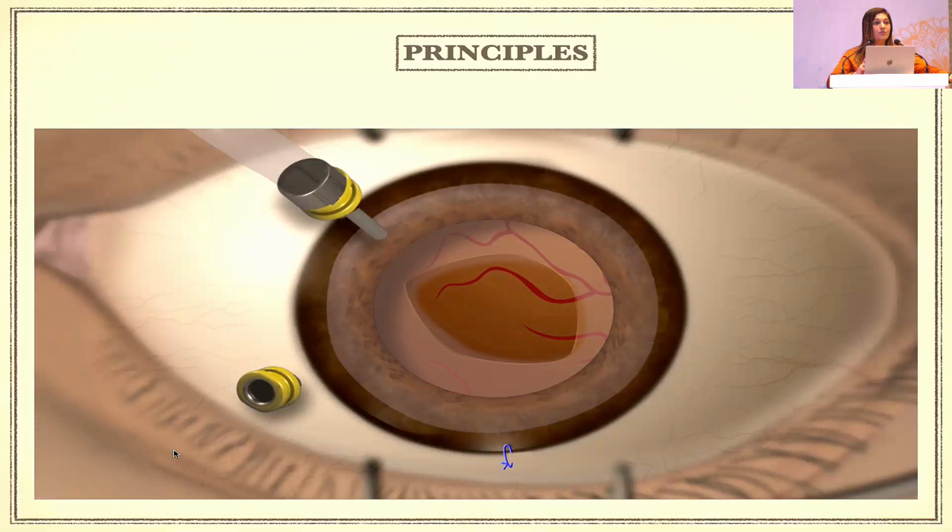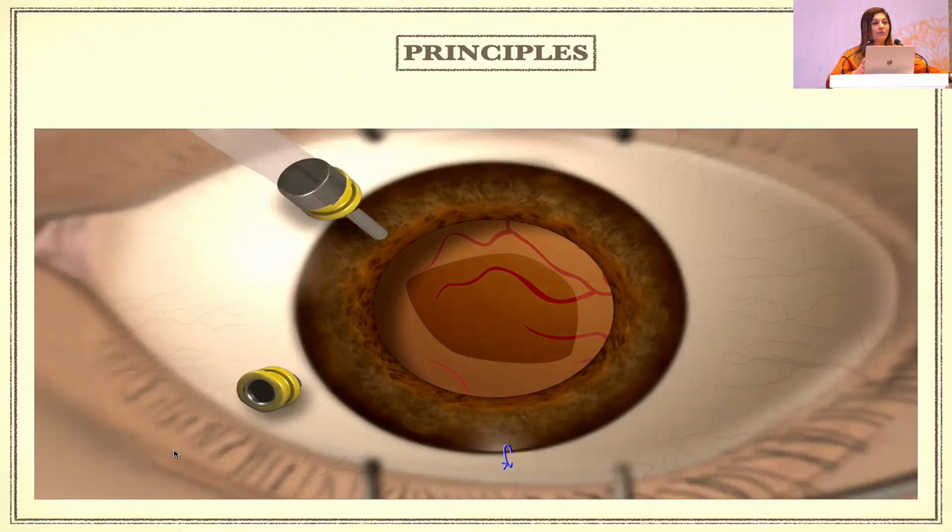The ideal thing is to place a trocar and shave off the vitreous that is bulging into the anterior chamber. Then the limited amount which is there in the periphery, you can clear by doing it from the limbal incision. So maybe you can use a combined approach here. But the concept of doing a pars plana vitrectomy, as Dr. Shell and as Dr. Lalit Verma have also highlighted, is a very important aspect.